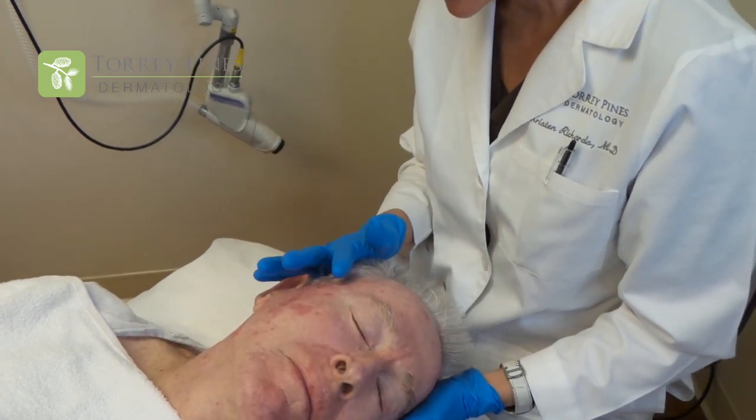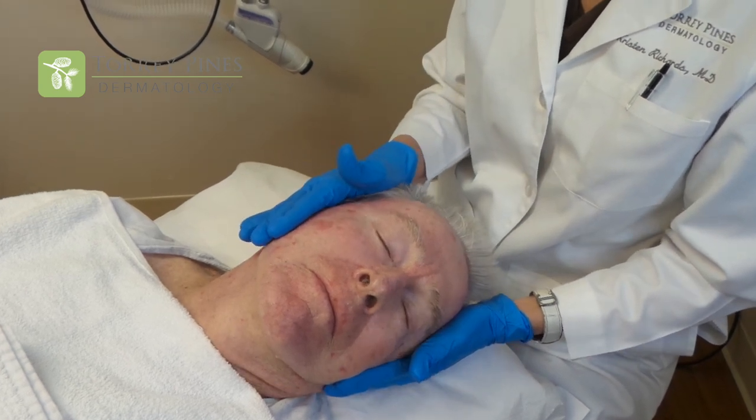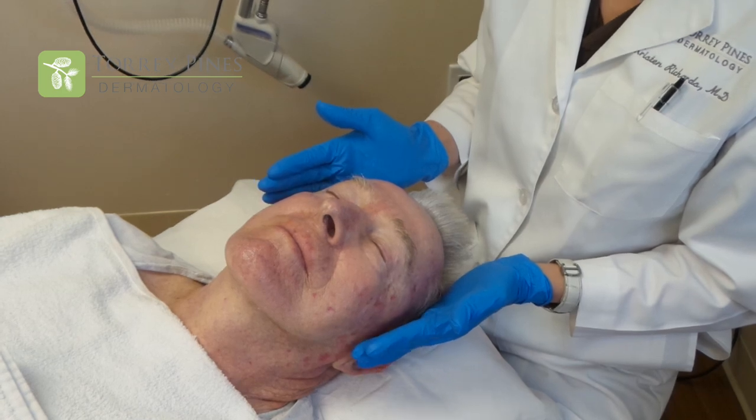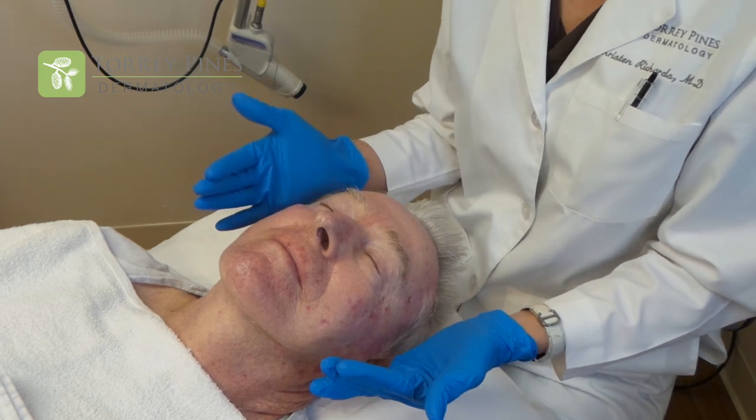Our patient has had a considerable amount of pre-cancer as well as skin cancer. Our goal today is to treat the entire area that's sun damaged so that his body can peel off that sun damaged skin and replace the cells with brand new fresh normal skin cells.